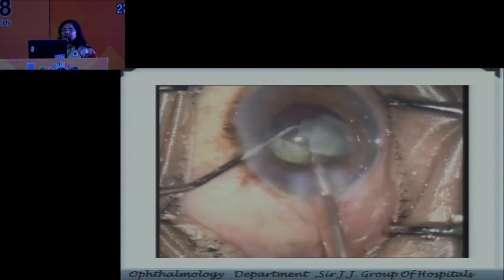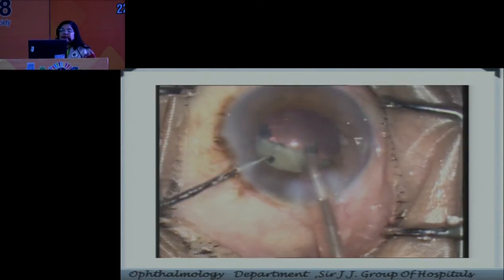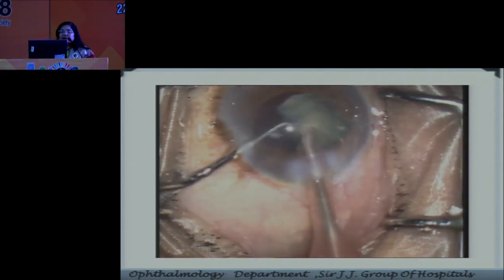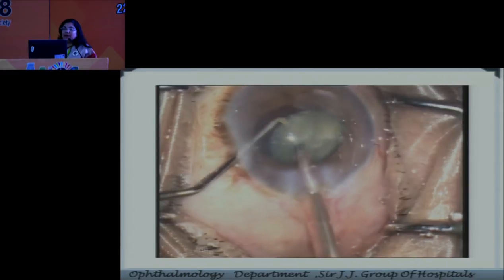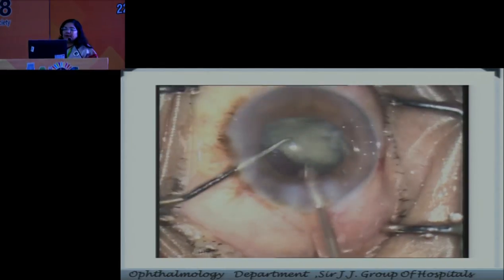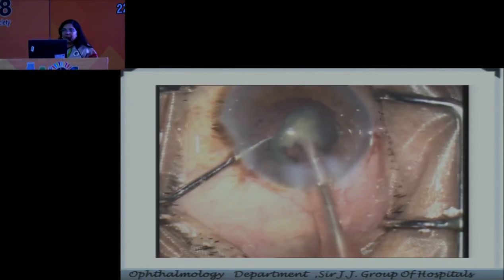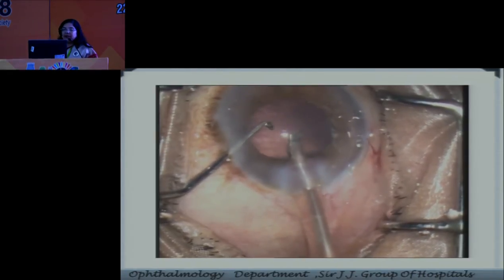Again, this is the second piece which is fed and rotated to bring the apex towards the mouth of the Phaco. The piece is rotated and held with the Phaco tip. The followability is very, very important. And then the nuclear pieces are chopped. So you can make multiple pieces and chop it. And so this is the stop and chop technique. Direct chop may not work in this case. Trenching is very, very important.